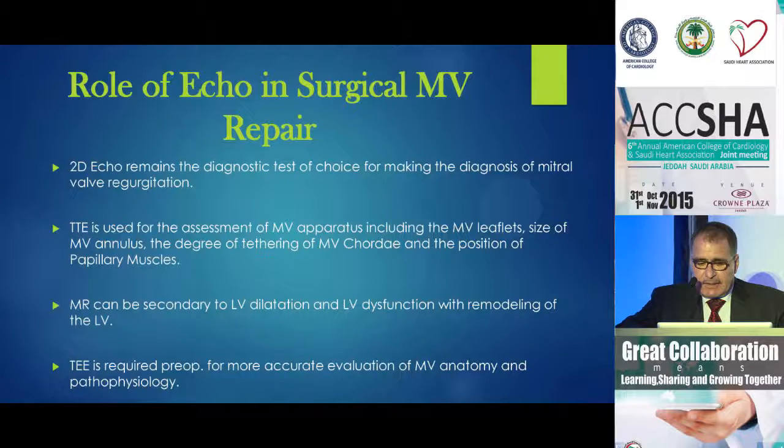And that's really where less invasive techniques for reducing or curing mitral regurgitation come to mind. Here I'm talking particularly about the less invasive transcatheter mitral clip, which I think will help a large number of patients, which is much more than I thought, indeed.